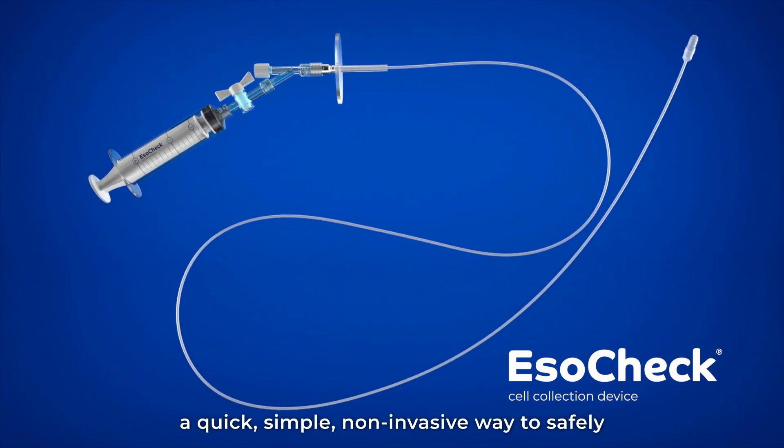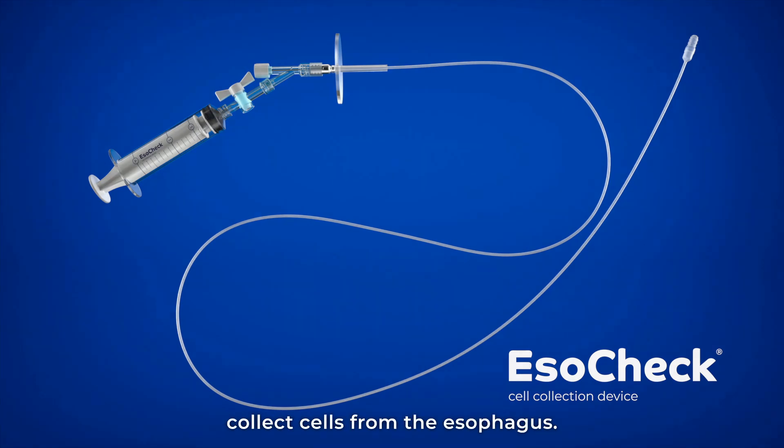EsoCheck — a quick, simple, non-invasive way to safely collect cells from the esophagus.